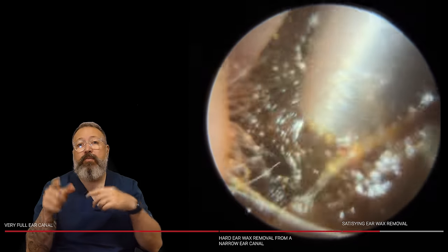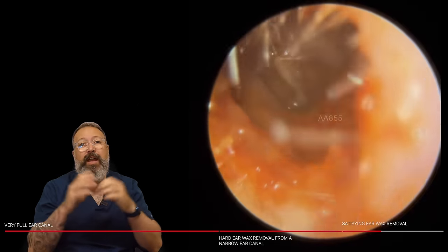Keep your questions and comments coming into the comment section. I am on holiday at the moment, but when I get back from my holidays — oh, now that looks like there might be a little bit of middle-ear effusion there. That usually looks like that sort of yellowish sheen to it — I would say there's probably a little bit of middle-ear effusion there. If you've got any comments or questions, drop them in the comments section below. I am away for this week as well, but when I get back I'll do some more questions — I've got enough of your questions to tide us over, and then once I'm back we'll go through your new questions as well.